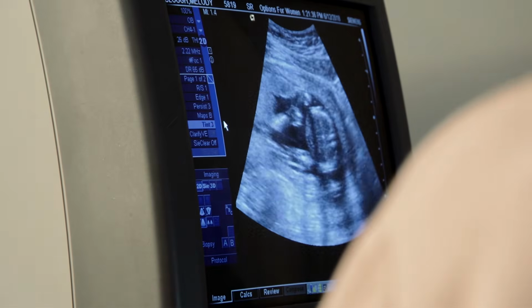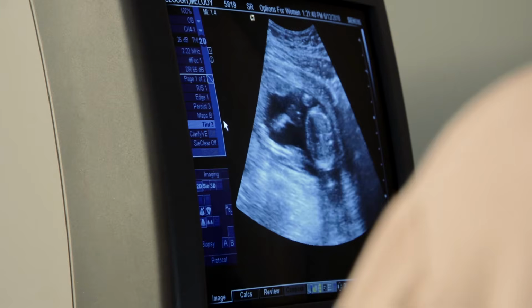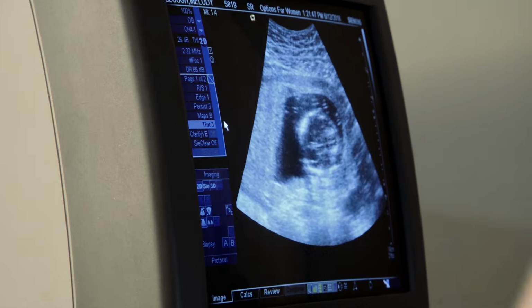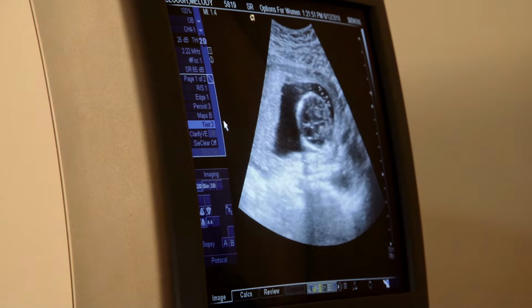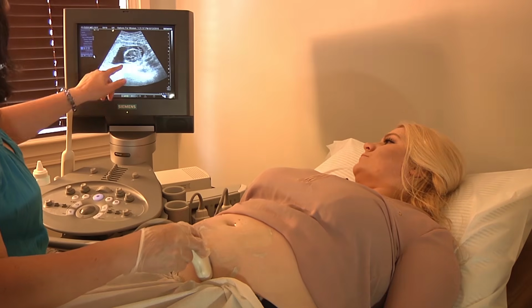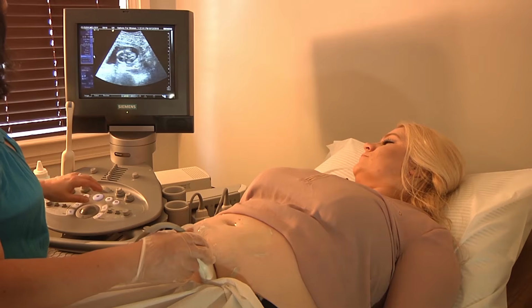All right, so wait, I want to go back. Oh wait, I kind of have the femur right there though. I think you can go get a BPD. You want me to go up? I bet he's in BPD position. Oh wait, maybe I could make it a little more like that. All you've got to do is do a little. Oh, you're so close. Freeze. But I don't have the whole thing. See, I don't like how that's obscured. Okay, you can keep tweaking and freeze.